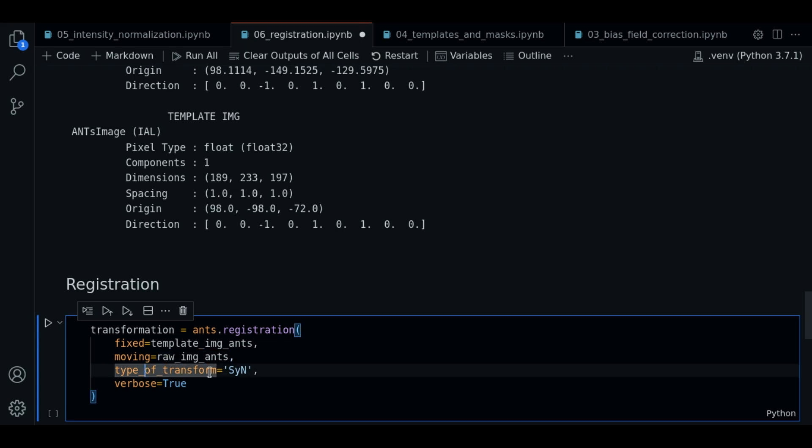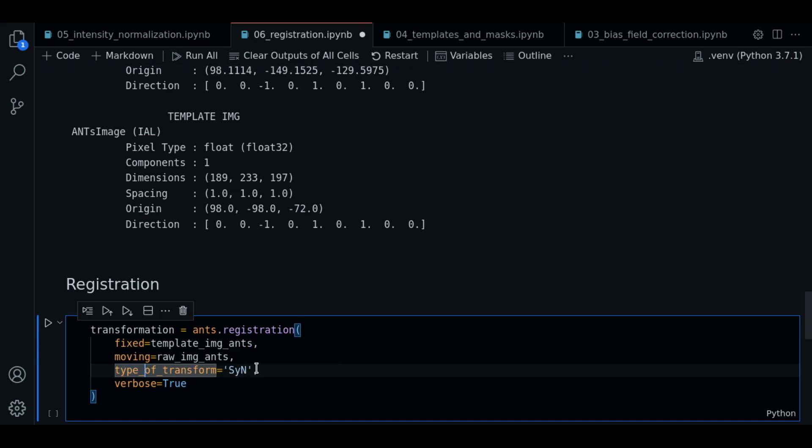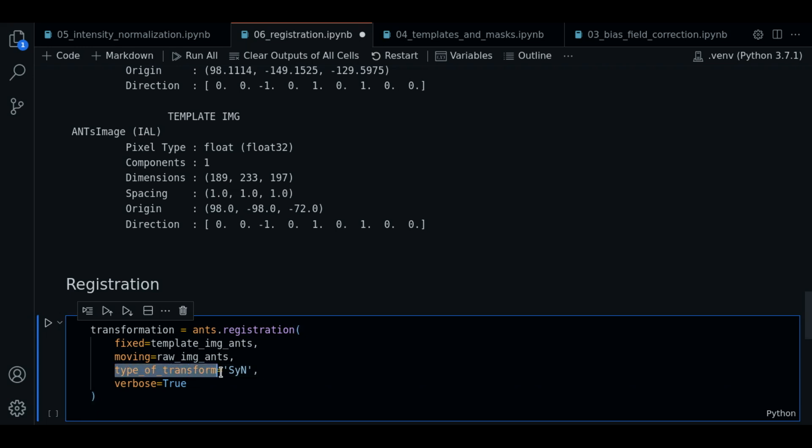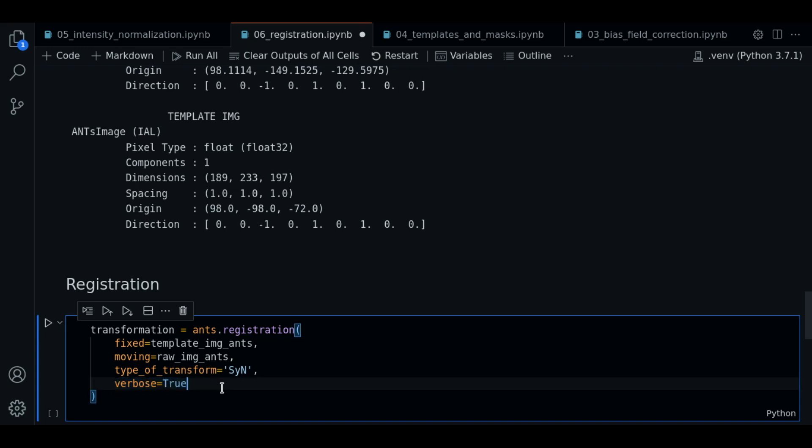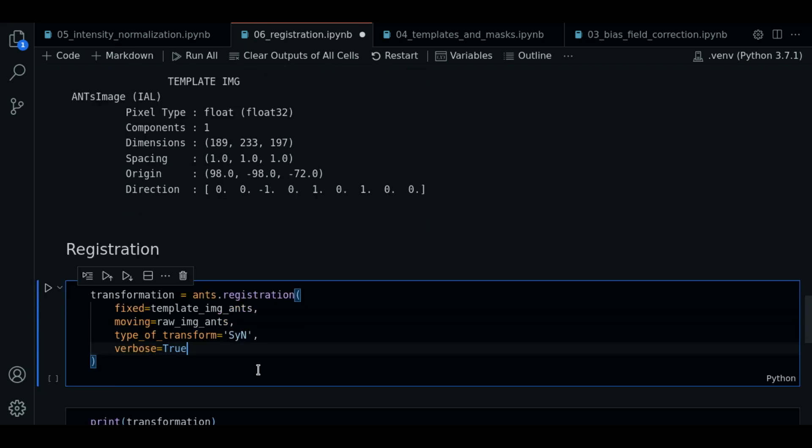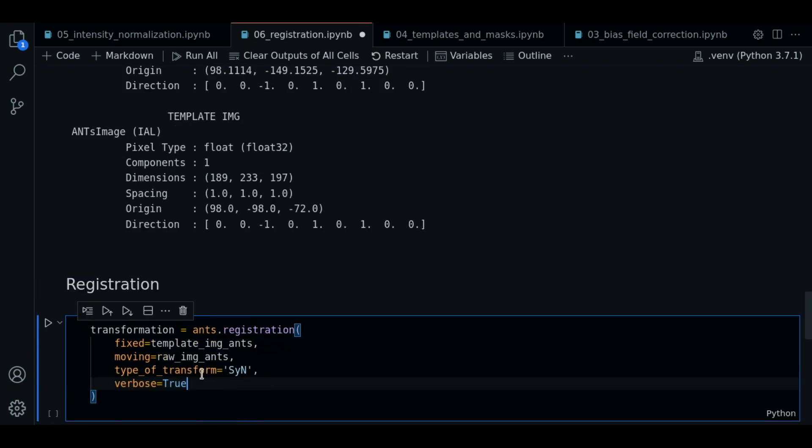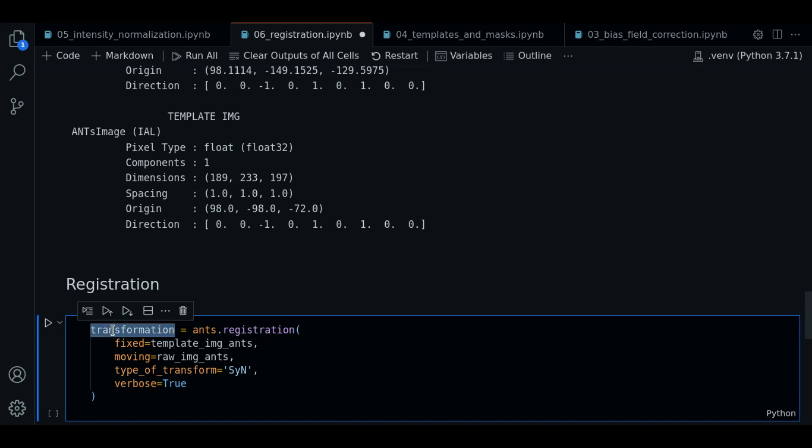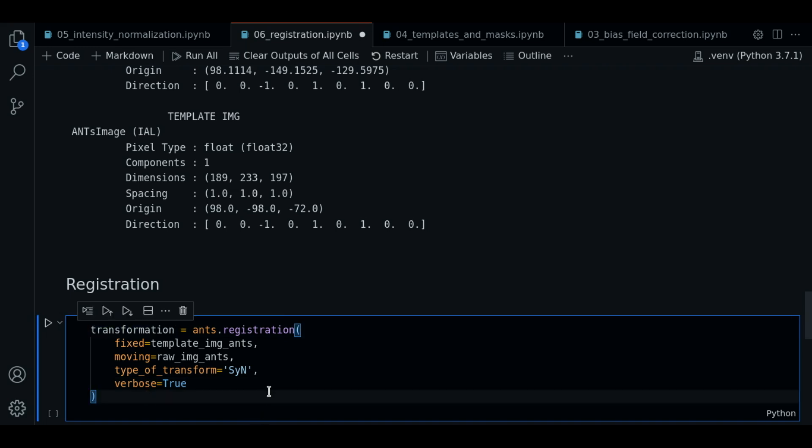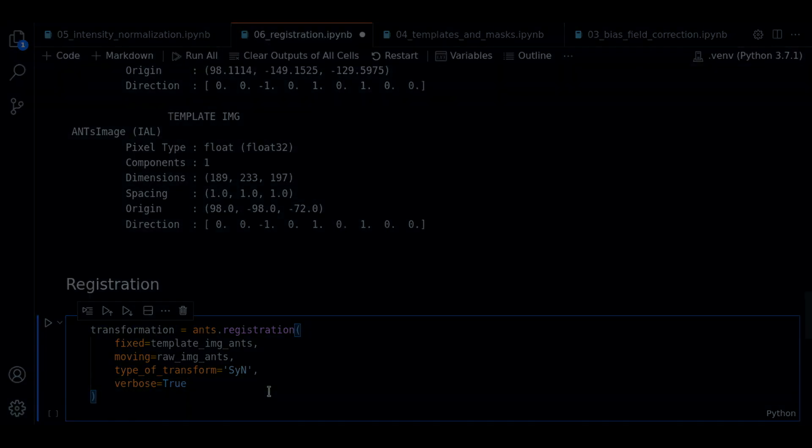So there is this type of transform parameter. I use this string as SyN. This is a default value that works okay for most cases, but you can check the documentation if you want to tune this parameter. So we pass the verbose true parameter. And now we are going to execute this cell. It's going to take some time so I will pause the video and we'll continue when it is done.